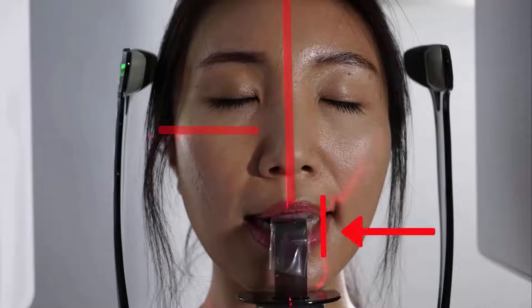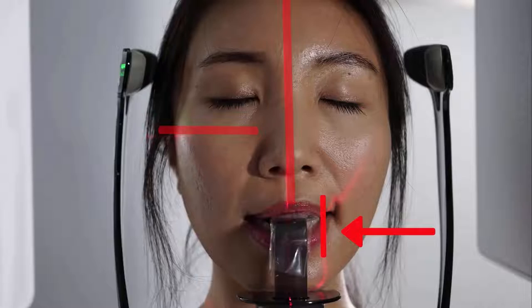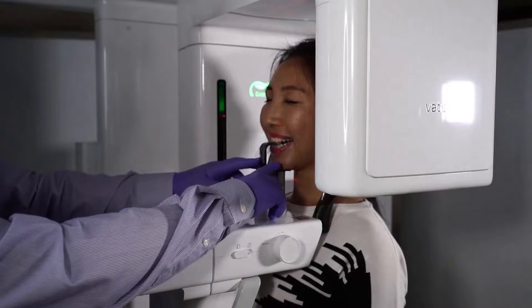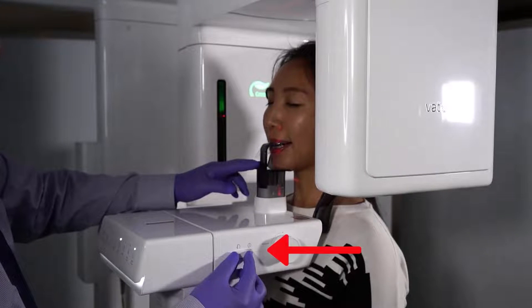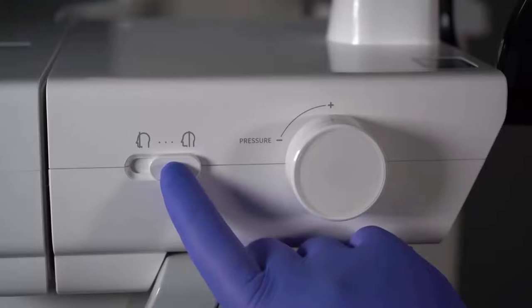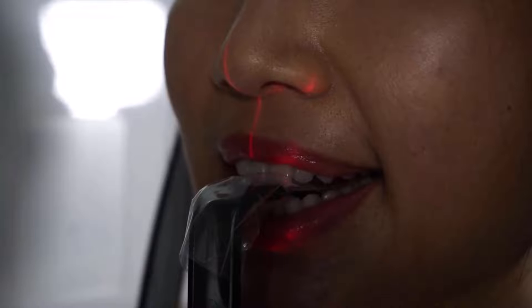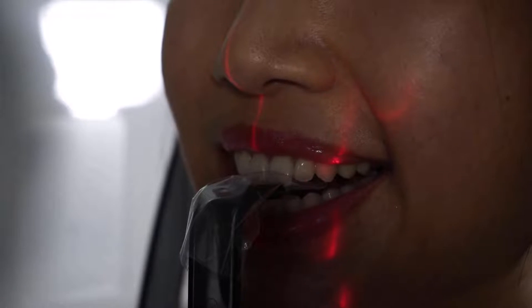Lastly, we will look at the canine light. The canine light should be positioned directly in the center of the canine so that it displays on the tooth itself. To adjust the canine beam, move the lever forward and back on the side of the machine. Have the patient smile and press on the cheeks if necessary to visualize that laser line directly in the center of the canine tooth.